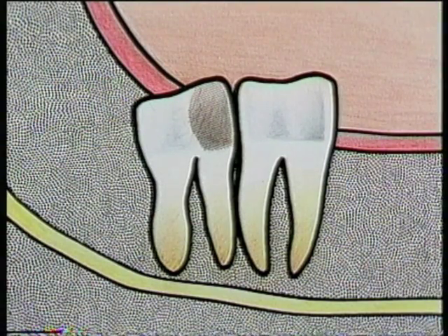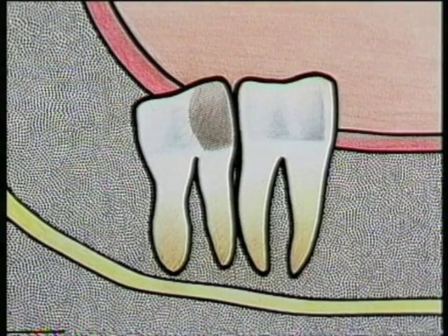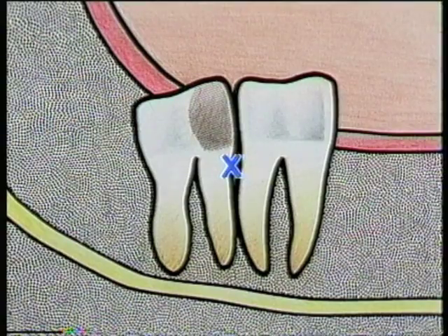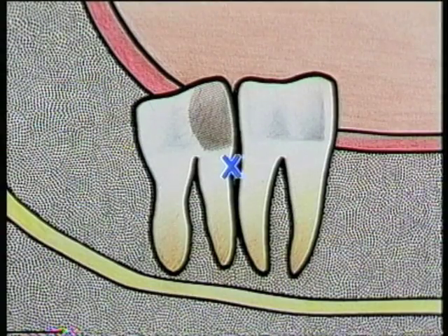In order to manipulate this tooth out of the socket, application of an elevator must be sought on a level adequately below the destruction, in order to encounter sound tooth substance. Thus, greater surgical exposure of the tooth is required.